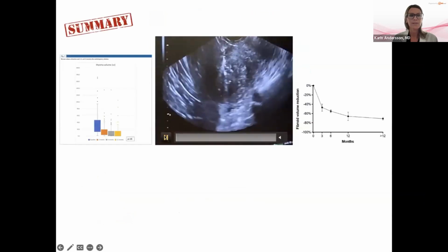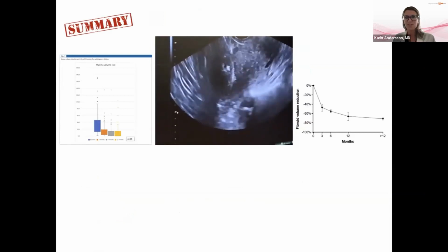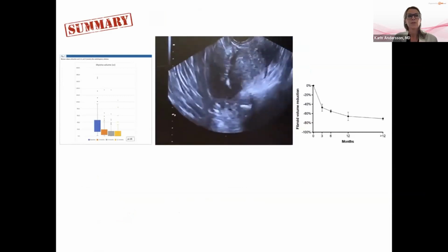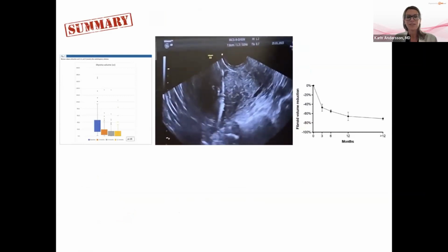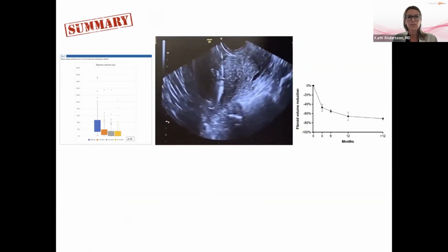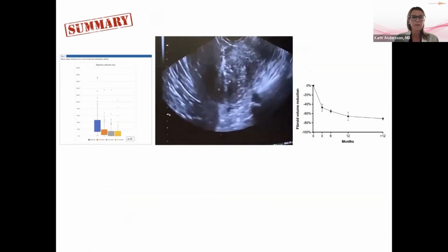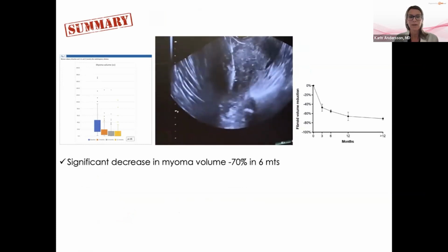So let's summarize a bit, which leaves us also more time for your questions. I see that some of you have been having questions as well. Summarizing what we've been saying so far, we have a significant decrease in myoma, around 70%.